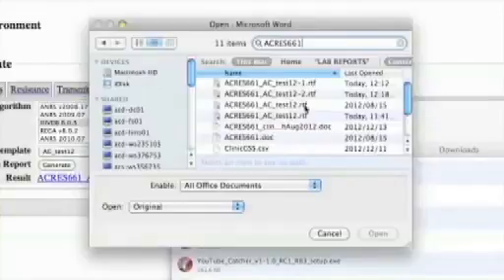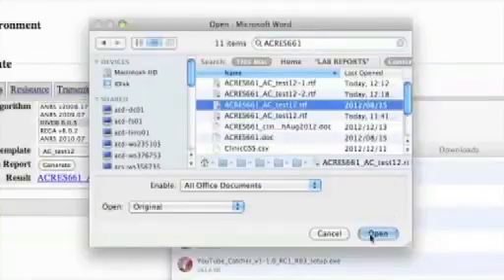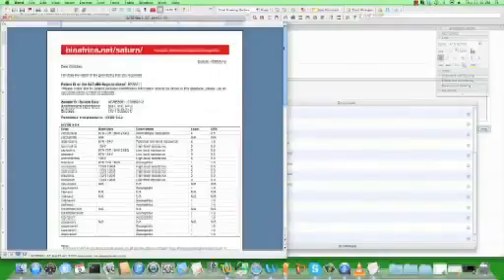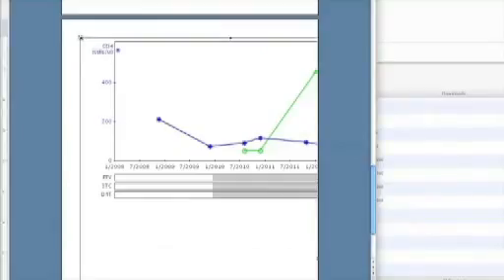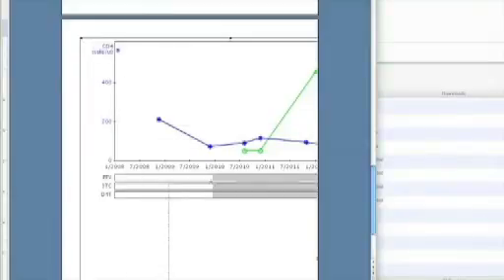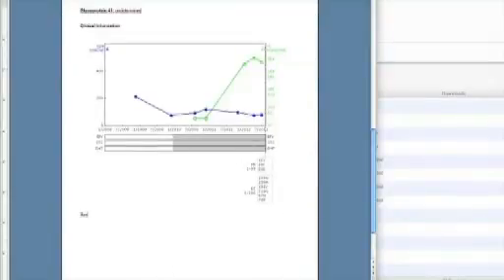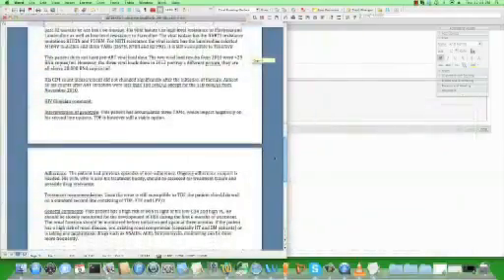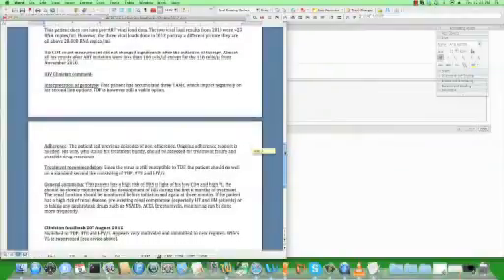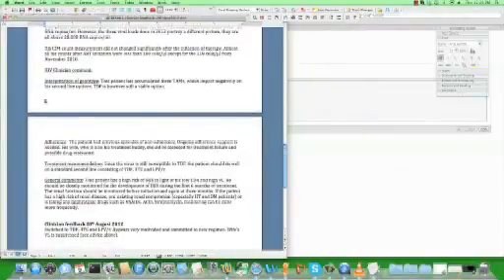Download the RTF document generated. Open the RTF document as a Word document. Resize the treatment history chart. After the chart, add the section Clinical Chart and Resistance Interpretation. Add a description of the patient's treatment history and the viral isolate's resistance profile. Also add a description of the patient's viral load and CD4 profiles. Send the report to the ID specialist for review and recommendations on future patient management.